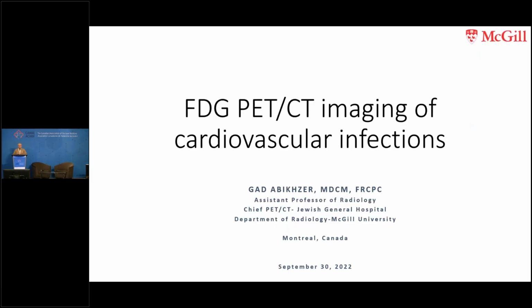We'll continue on now with Dr. Abikhzer, who is a nuclear medicine specialist in Montreal working at the Jewish General Hospital. He obtained his medical degree at McGill, followed by the fellowship training, and then went on to Haifa, Israel to do a 2-year fellowship dealing with novel SPECT CT and PET CT hybrid cameras, as well as novel radio tracers. And he's published multiple articles, interests in whole body SPECT scanning, as well as an interest in infectious imaging with PET CT. And as you notice on his discussion today, we're going to be looking at cardiovascular infections using PET CT. And the podium is yours, sir.